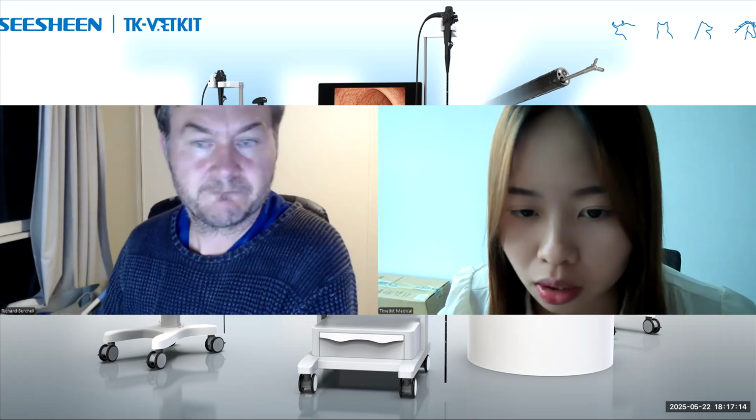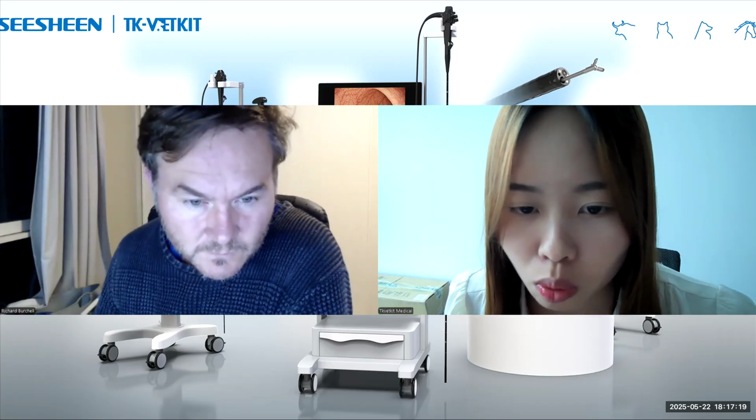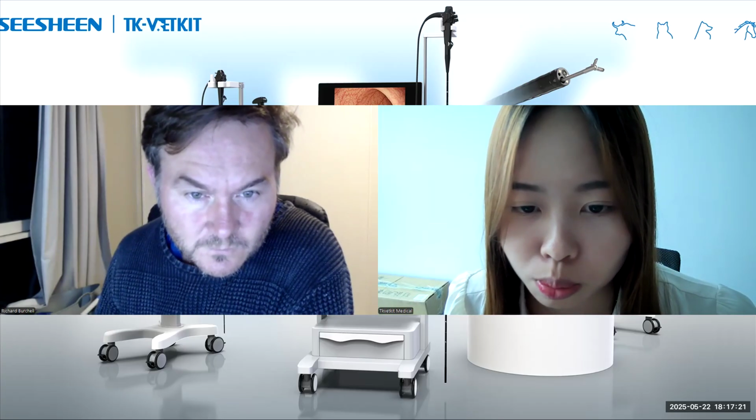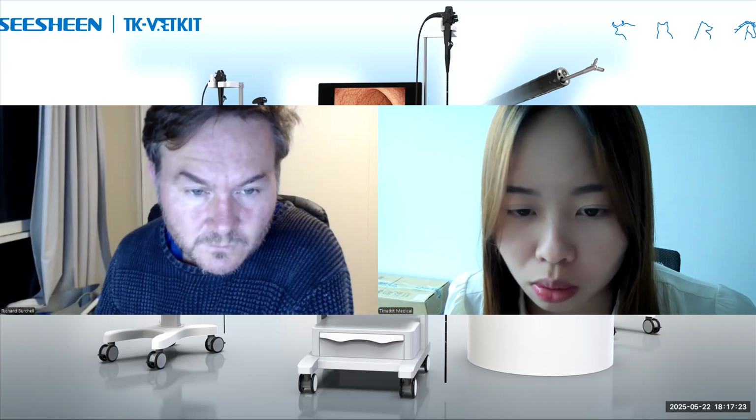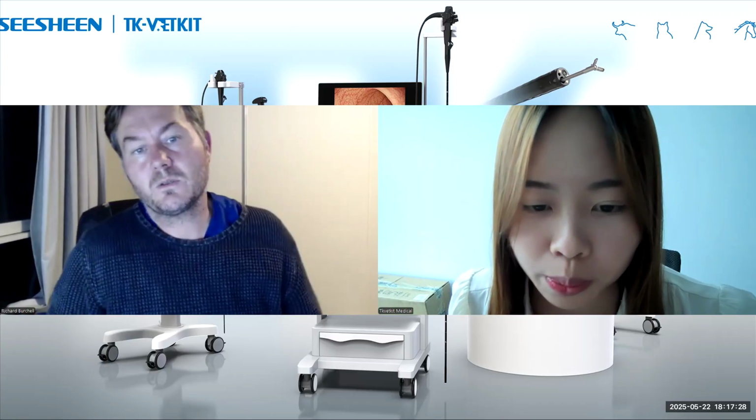Can you see the latest question from Dr. Wellist, maybe? Please, can you repeat the anesthesia type used during bronchoscopy?